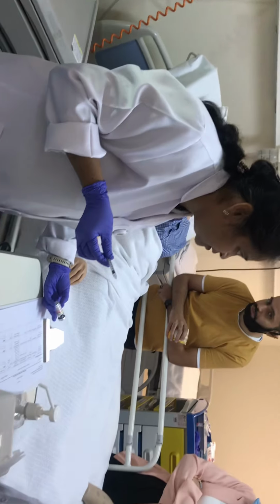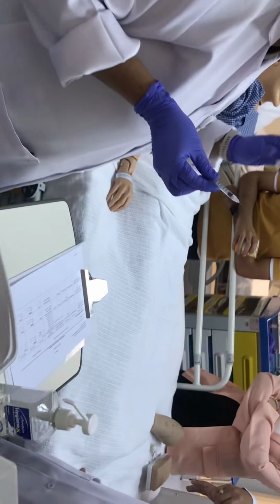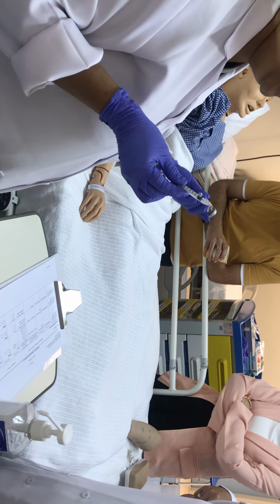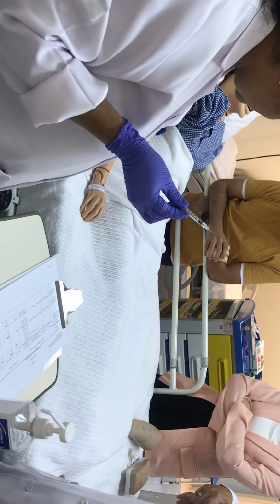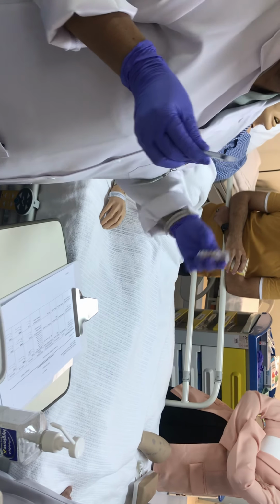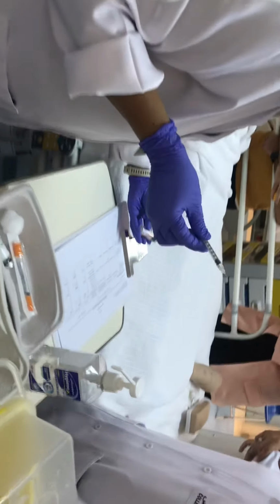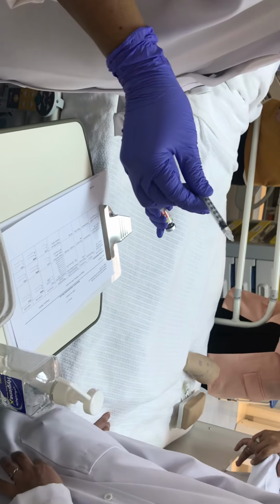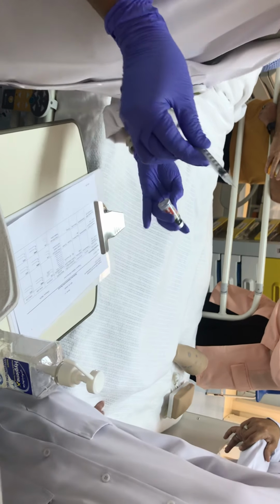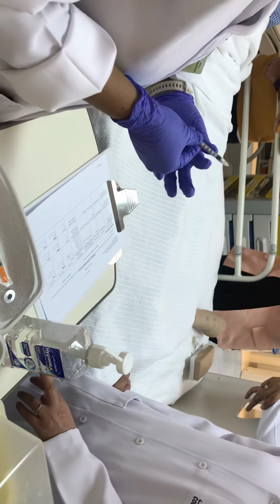Then the third check. This step everybody forgets. Third check. Because even if they don't do 1 check, we can fail them. But so many times we are gracious with them. We ask them, is everything done? Then they remember. But please, when we are practicing, if we tell that to them, then they will remember. So check the third check. Regular insulin, 100 units per ml, it's available. Because the sugar level is 18, we are taking 10 units, not expired. Okay. Now I go to my patient.